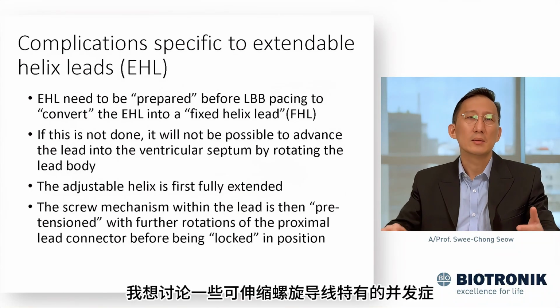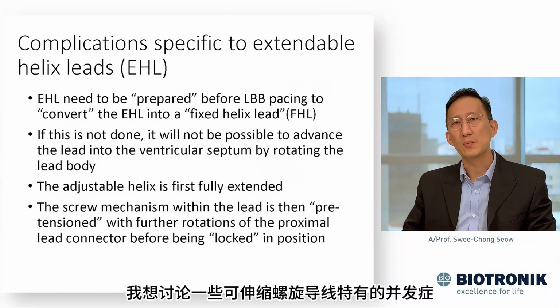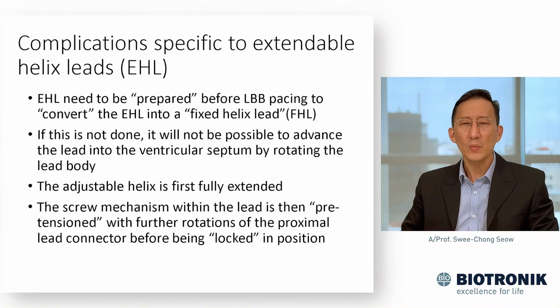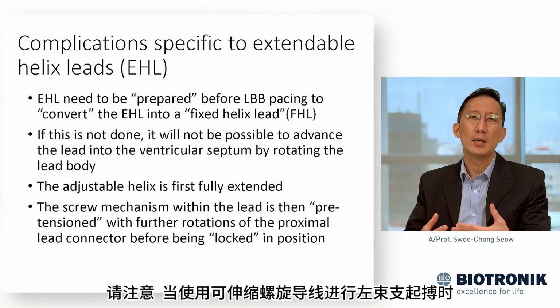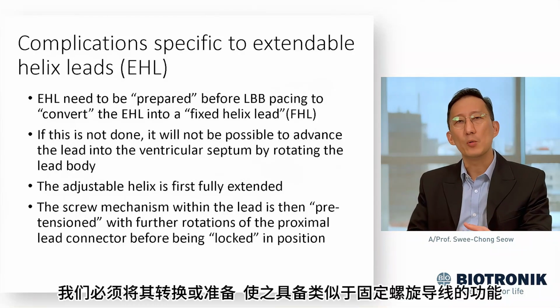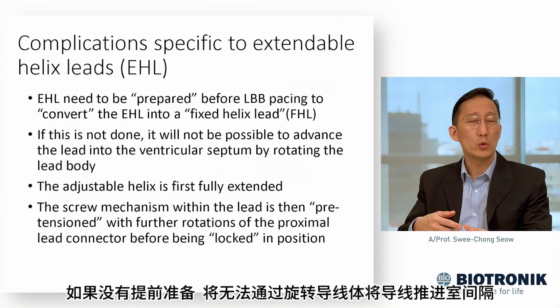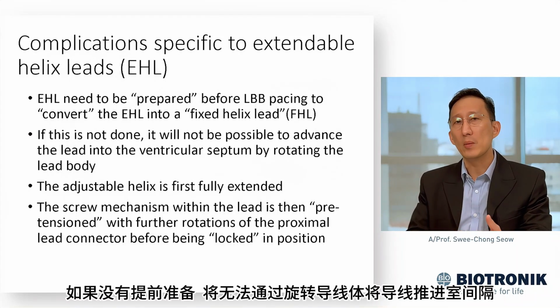I wanted to cover some of the complications which are specific to extendable helix leads, bearing in mind that when you use an extendable helix lead for the purpose of left bundle branch pacing, we really have to convert or prepare the lead in such a way that it becomes functionally like a fixed helix lead. And if we do not do this ahead of time, it will not be possible to advance the lead into the septum by rotating the lead body.